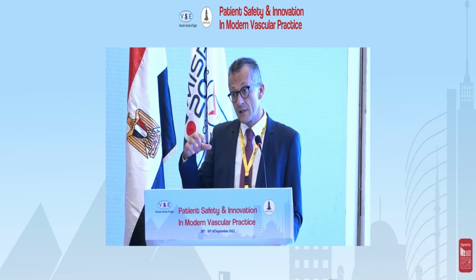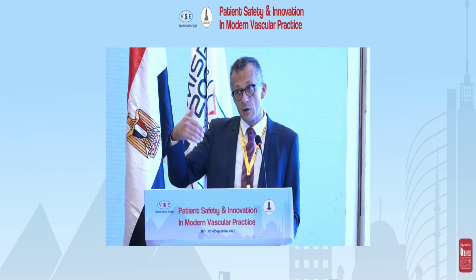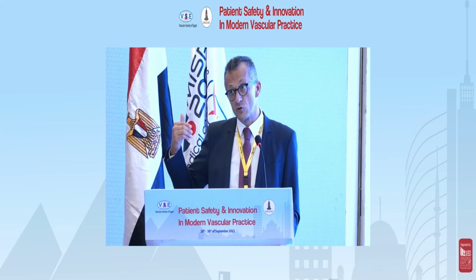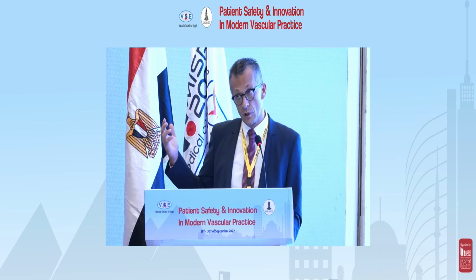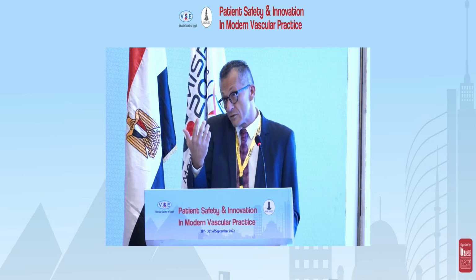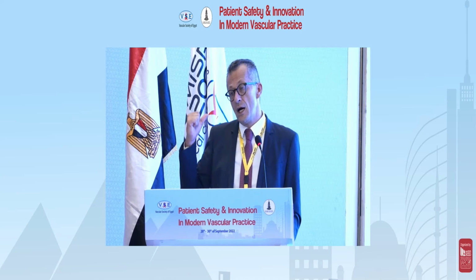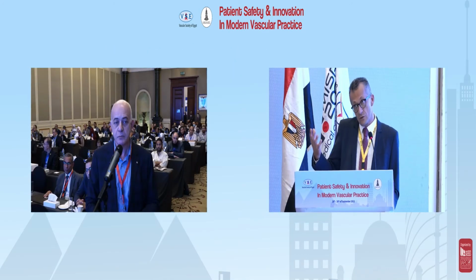This is the reason why it's really, really important to maintain a continuous lubrication of the device, to avoid thrombosis and to remove the material through the device. Then it's possible to go from below to above in retrograde without blood flow. But we have to place a sheath bigger than the Rotarex, and maintain a continuous infusion around the device.